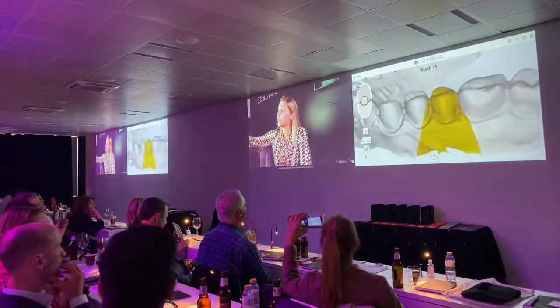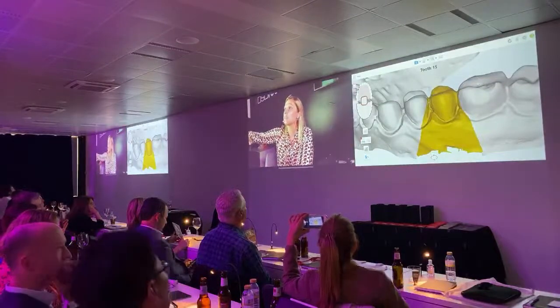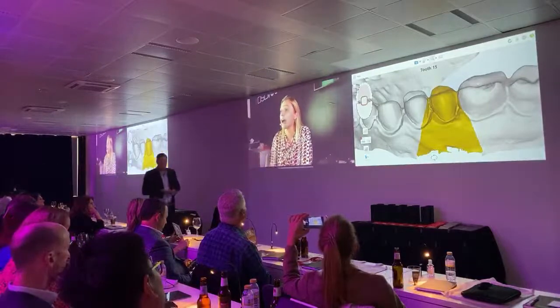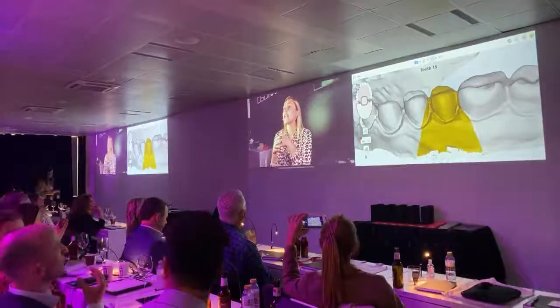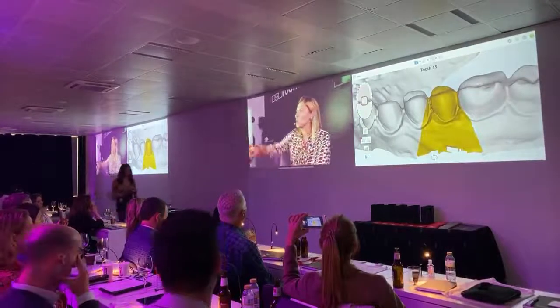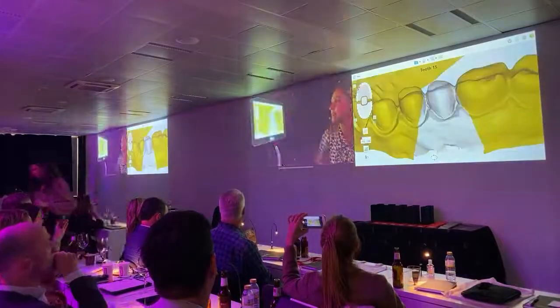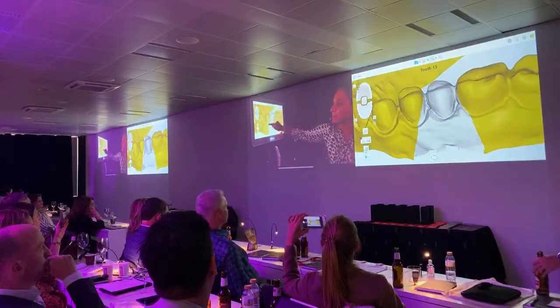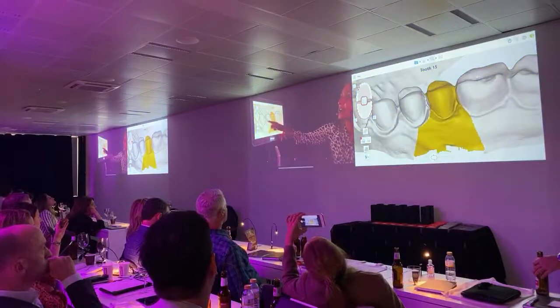If you leave it that way and you have high definition of the 15 over the 14, you have damaged the STL file. It's gonna have an overlap of images. So you go in, for example, here less, you're gonna add here in the 14, and then you go plus, and then you got out from the 14.